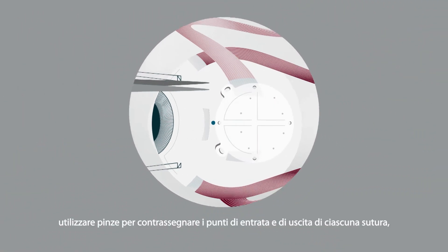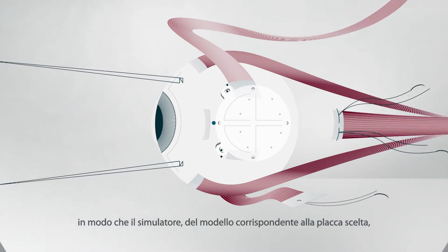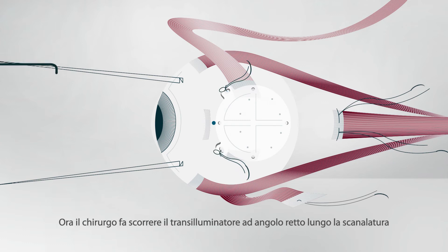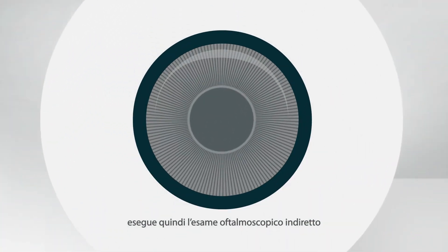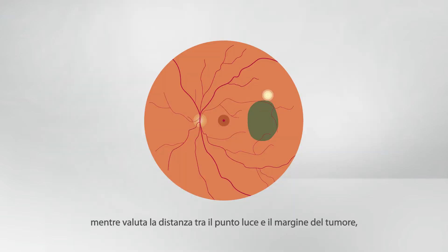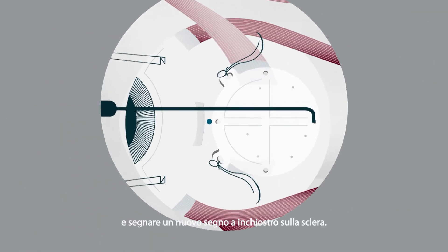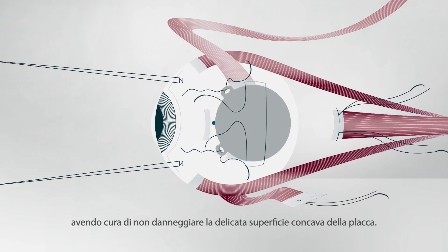If a D'Amato template is available, forceps or calipers with pointed tips are used to mark the entry and exit points of each suture, so the template corresponding to the selected radioactive applicator can be sutured to the sclera with releasable bows. The surgeon slides the right-angled transilluminator down a groove until it clicks into a perforation, then performs binocular indirect ophthalmoscopy to elicit the sunset sign while assessing the distance between the light spot and the tumor margin, ensuring the tumor including safety margin is completely covered by the template. If the template is not perfectly positioned, it can be adjusted using the transilluminator as a hook and a new ink mark is made on the sclera. A mattress suture is placed and left loose. The template is then replaced with the radioactive applicator, taking great care not to damage the delicate concave surface of the plaque.